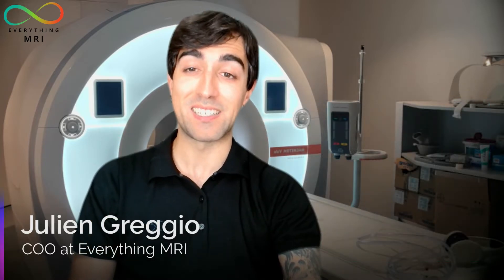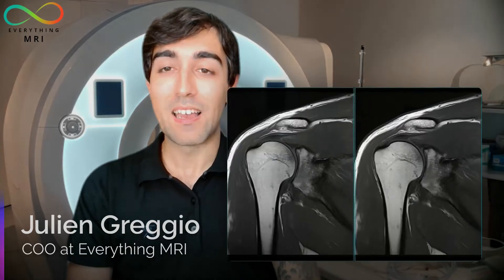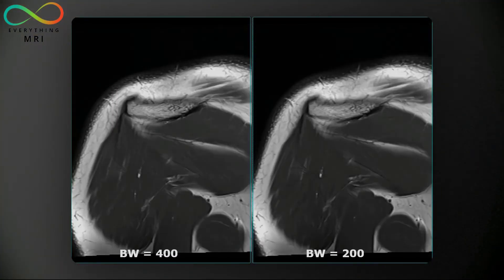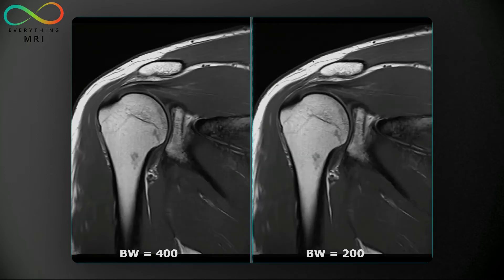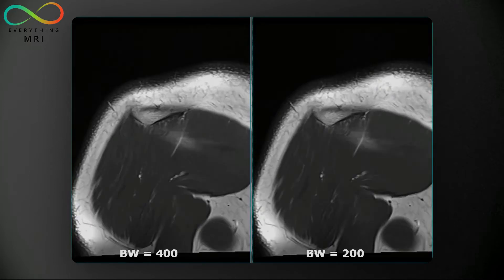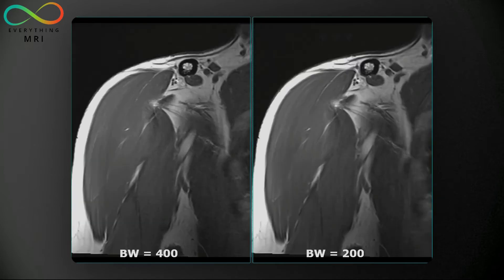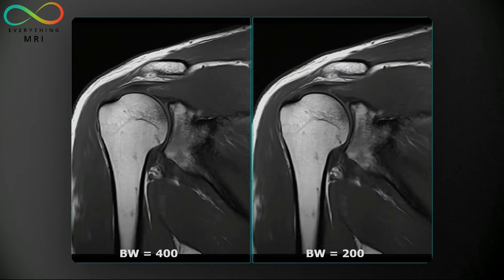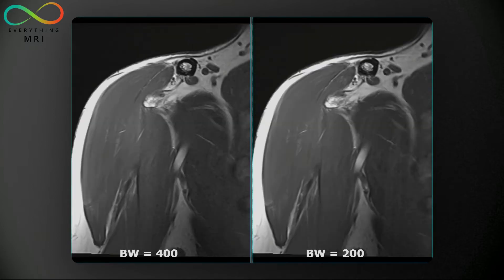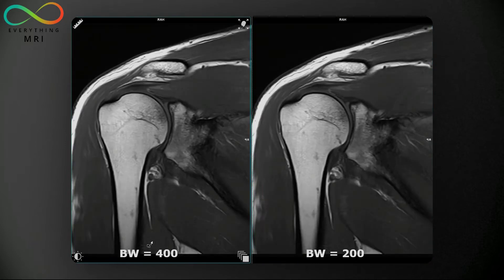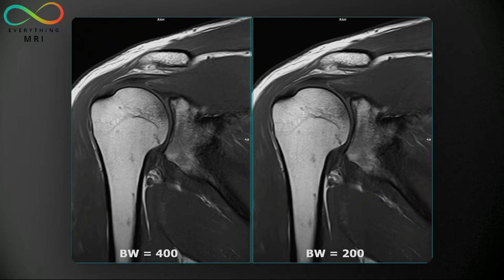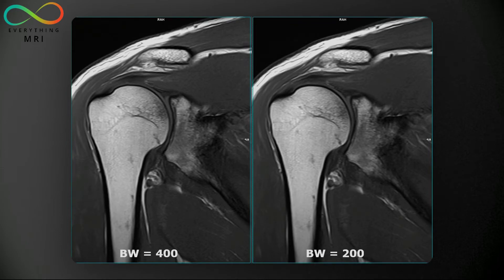Can this be generalized to every weighting? Similar experiment, different weighting. We are dealing here with a TSE coronal T1, non-fat-sat — one acquired with a high bandwidth, the other with a low bandwidth. Spotting the differences can be a little bit more challenging this time. What I can see is a very mild reduction of SNR in the sequence with higher bandwidth, especially around the muscles surrounding the shoulder, but the difference is way less marked compared to the previous example.